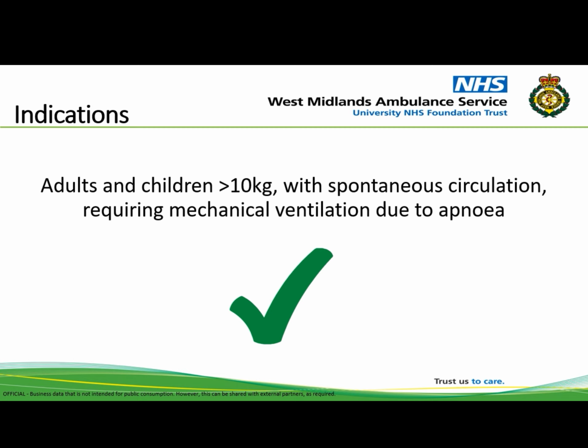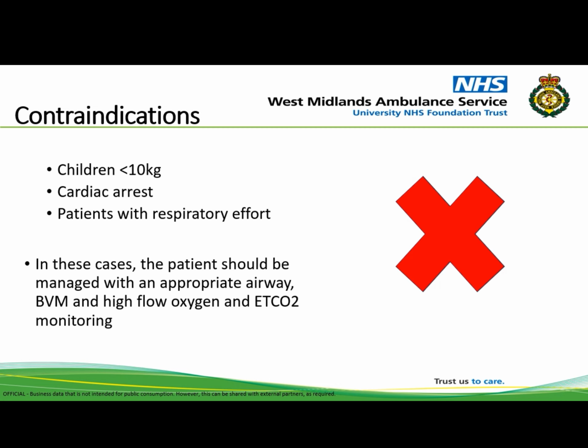The indications for use of this ventilator are adults and children greater than 10 kilos with spontaneous circulation requiring mechanical ventilation due to apnea. Contraindications include children less than 10 kilograms in weight, any patient in cardiac arrest, and patients with respiratory effort. In these cases, the patient should be managed with the appropriate airway, bag valve mask, and high flow oxygen with end-tidal CO2 monitoring included.